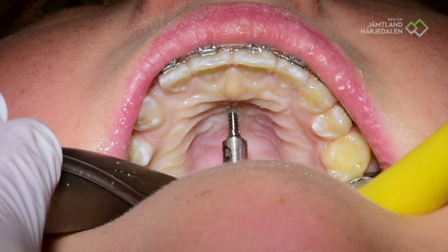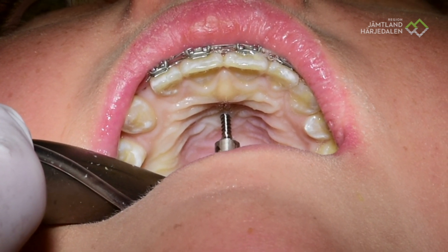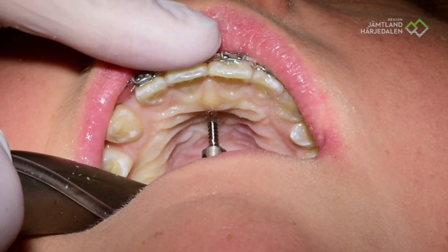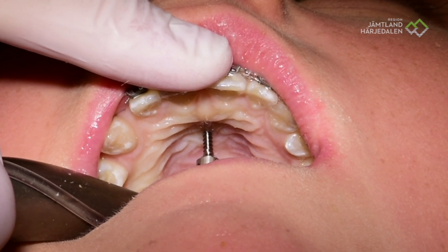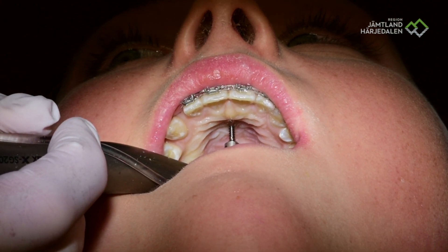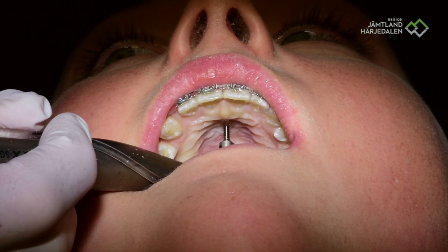Now I am halfway — half of the piercing is inside. You did not feel anything. What will happen now is that you will feel a little pressure on the frontal teeth, like I am pushing on the frontal teeth. The more I press, the more you feel it, and the better this piercing will sit. Maybe, if you are very lucky, it will tickle a little bit inside the nose at the last three seconds — but it's not sure.